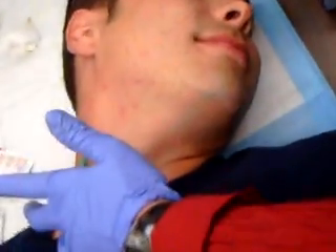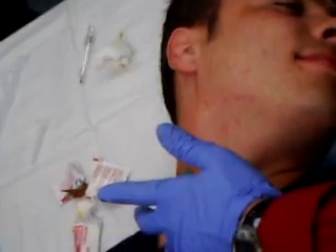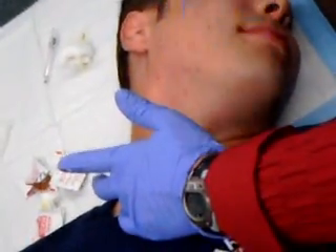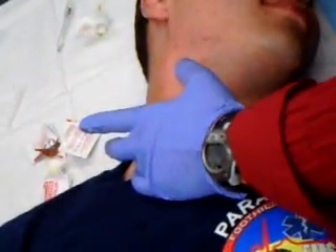I'll let some look out. How you doing there? You're happy? Okay. So there it is. That's that. They're actually — I think they're a little bit easier to do than ACs because there's no fossa, there's no dip. And I think they're easier than hands because they're so big. So don't let EJs be any sort of problem for you.